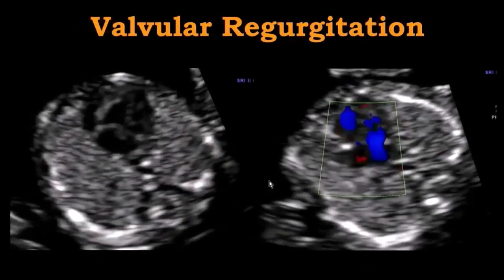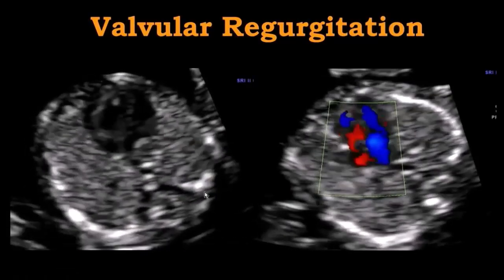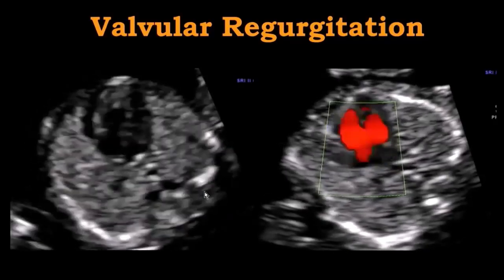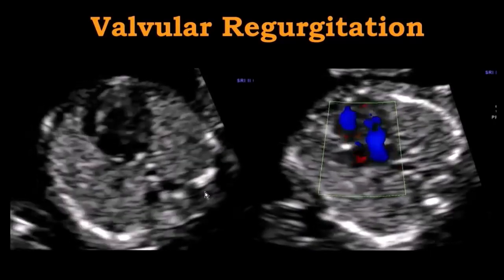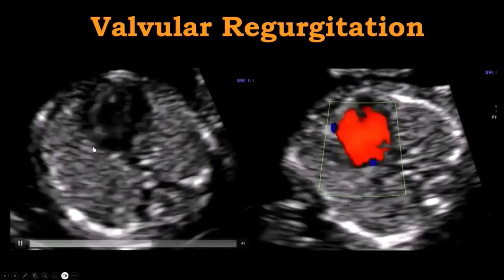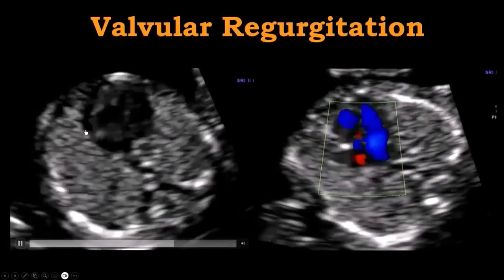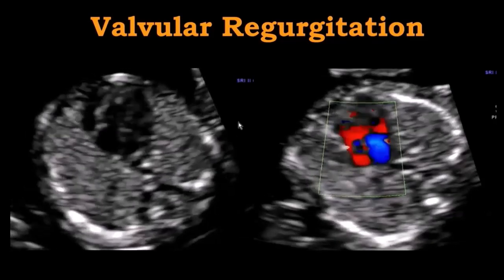Here we can see a patient who was referred for early assessment with very poorly controlled diabetes. As the A1C rises over 10, as was the case here, we may expect major structural cardiac anomalies. The four-chamber view looked pretty much okay. We can see some fluid here, which is not that uncommon in diabetic patients in the first trimester.